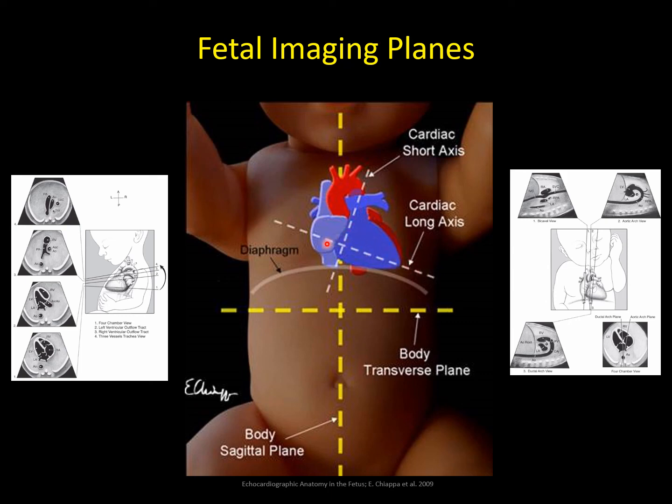So this is important to keep in mind when doing your scan. And again, when you're doing these views, you may need slight rotations here and there, just to get things to look quite right.